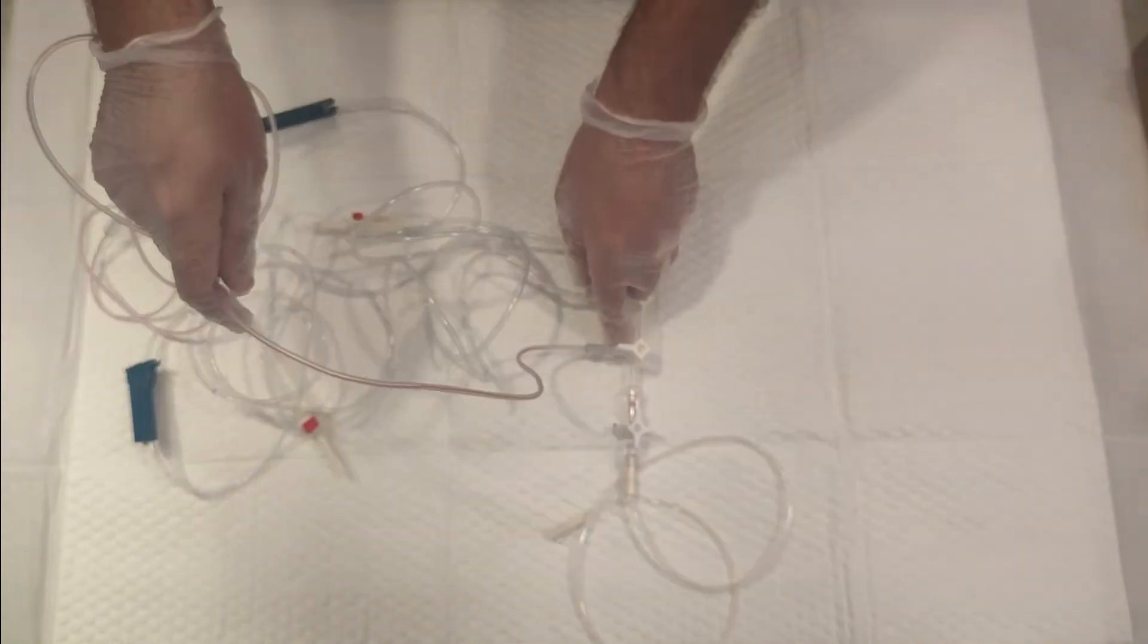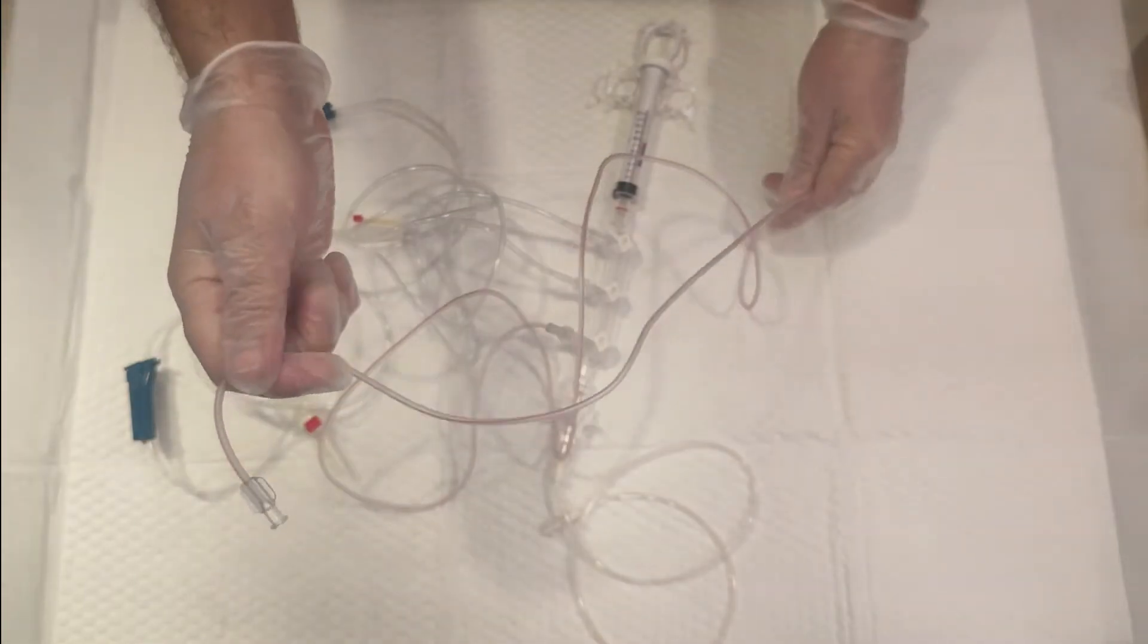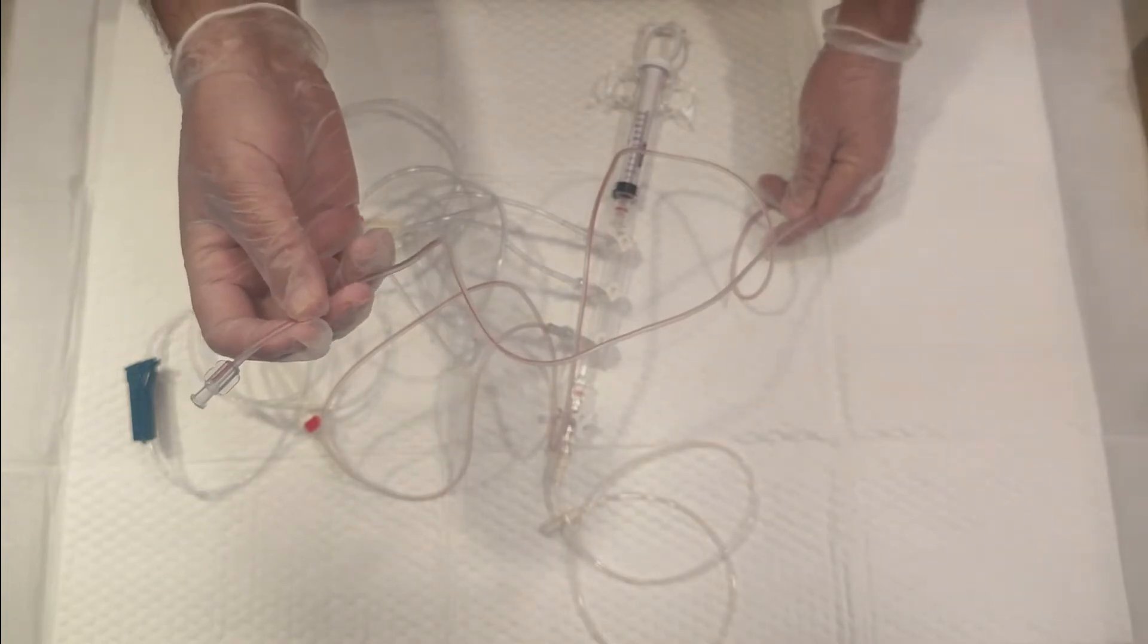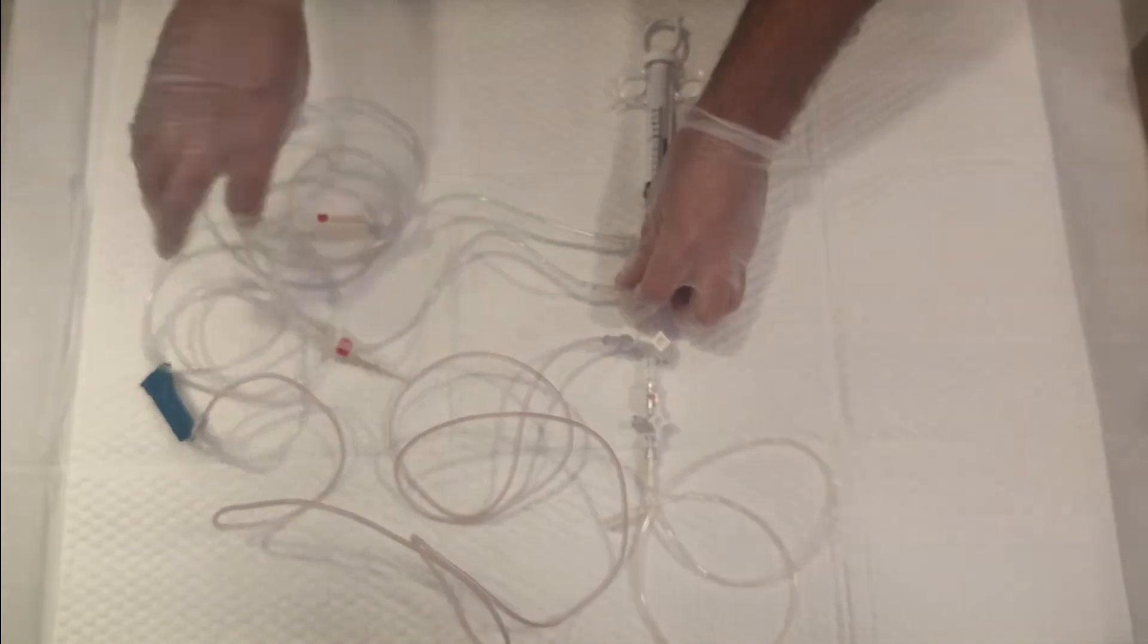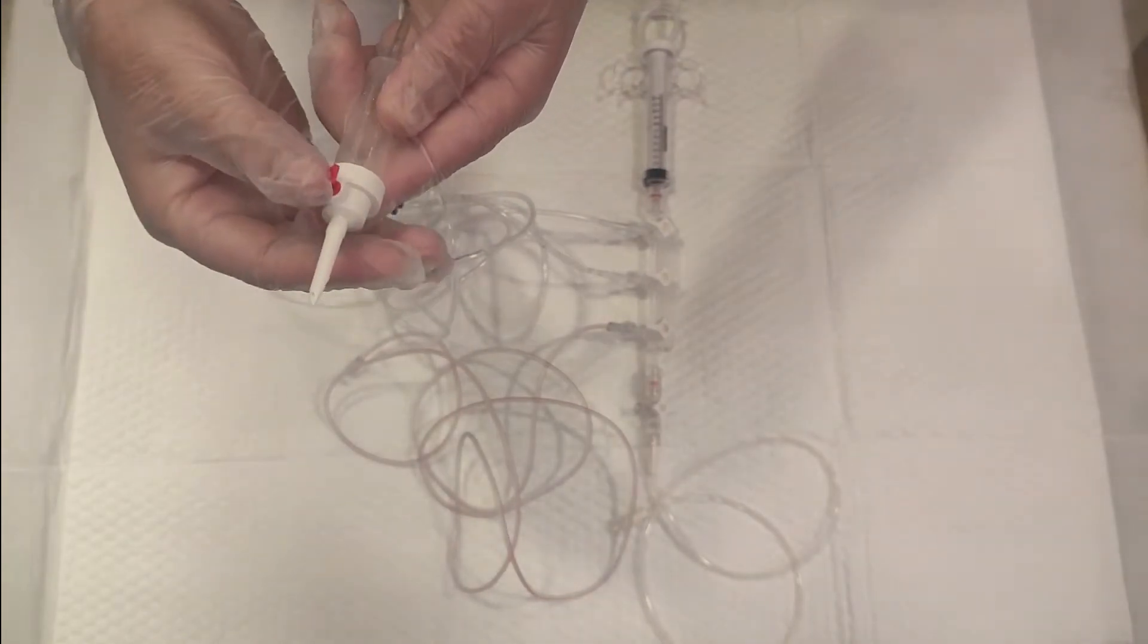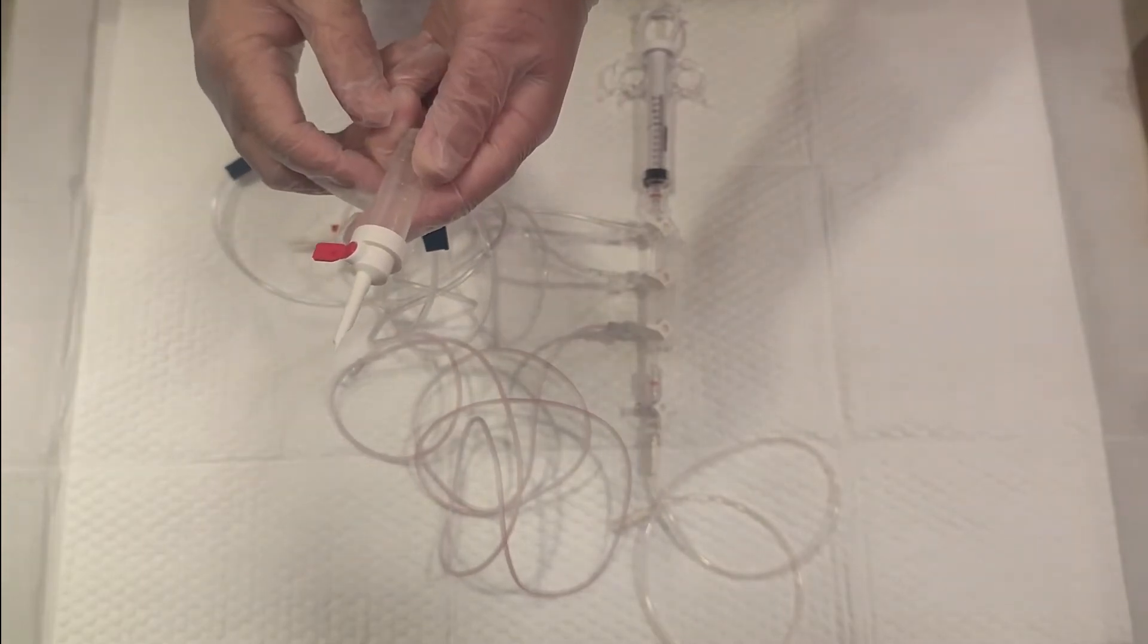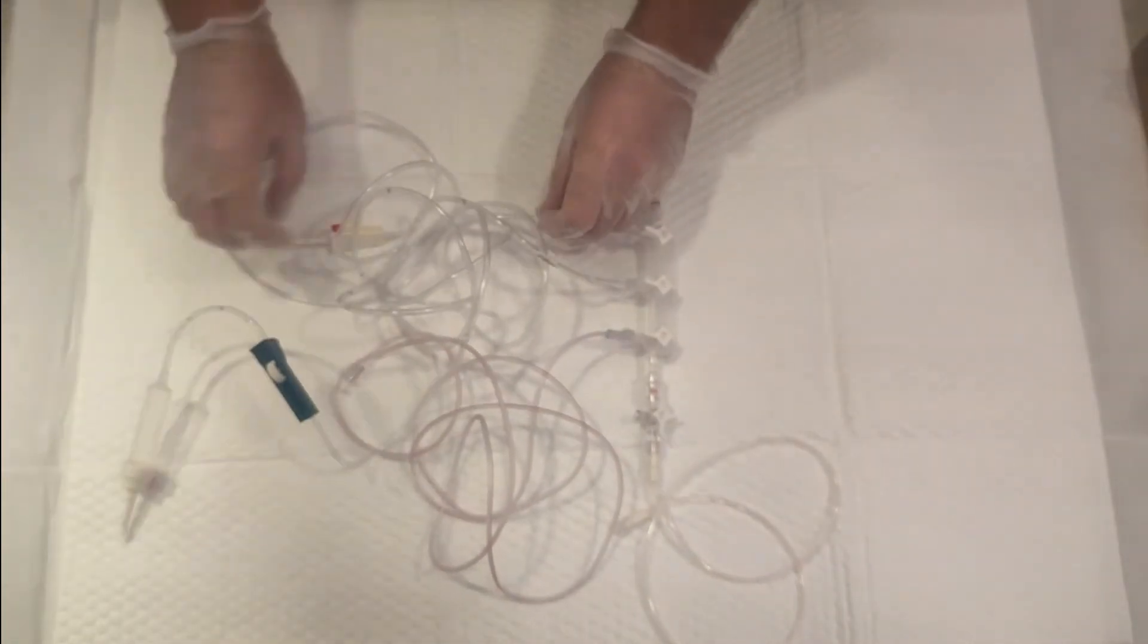This first pressure monitoring line will go to the pressure dome, which you've already prepared during the cardiac cath procedure. You'll use a pressurized bag with normal saline. The second line will go to the pressurized saline bag. Make sure this port is closed because if it's open, it will leak all the pressure.